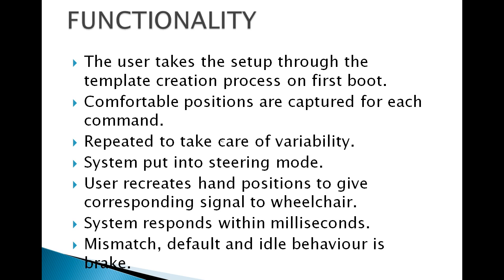After this, the system can be put into steering mode, and the monitor that is used during the initial template creation process can be disconnected. The user then recreates these hand positions in front of the image capture to control the wheelchair, and the system ideally responds within milliseconds. All mismatches default, and idle behavior is treated as brake to ensure the safety of the user.